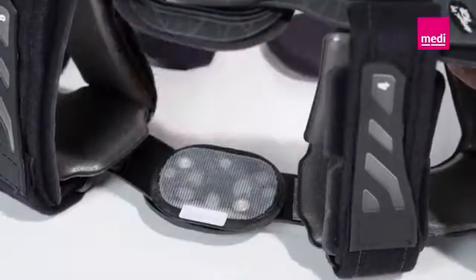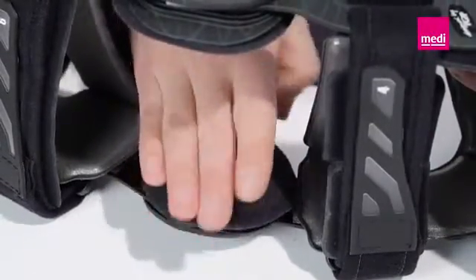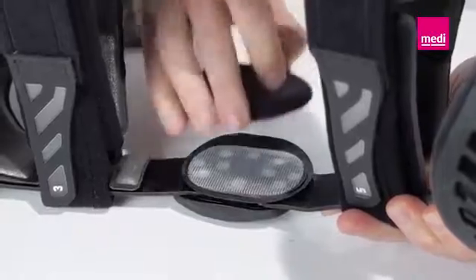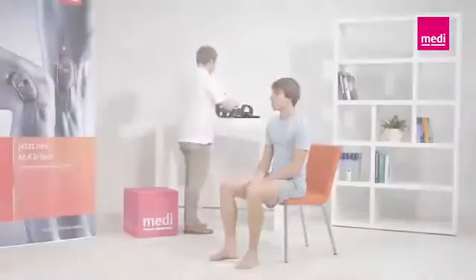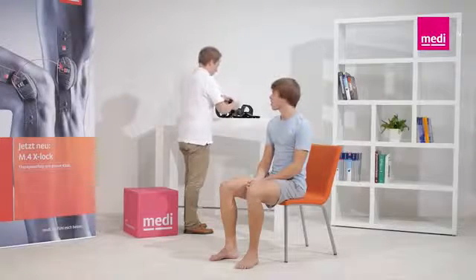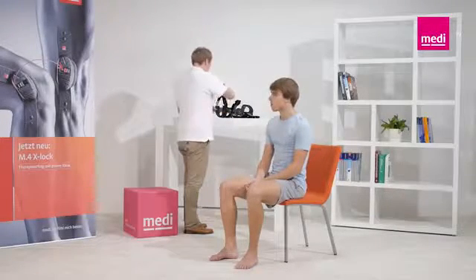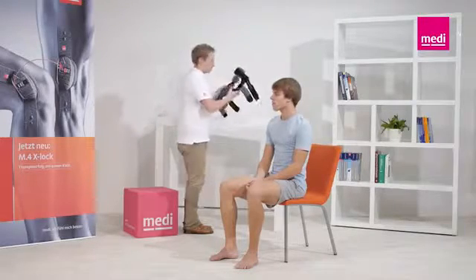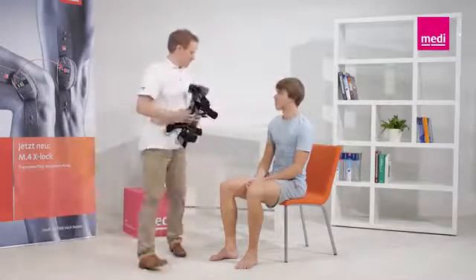Replaceable pads can also be used on the medial sides. This guarantees that the orthosis fits perfectly, even on very thin knees or where swelling varies. The orthosis should be worn directly next to the skin to ensure the best possible fit. Whenever possible, put the M4S lock on with the legs straight.